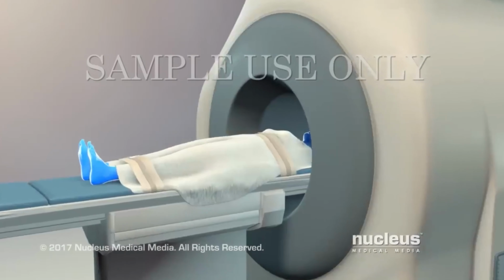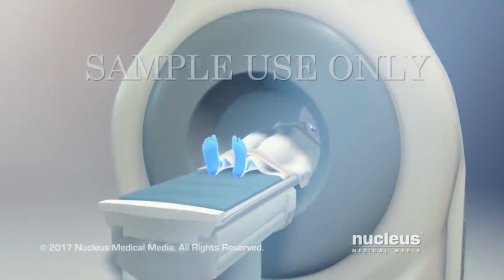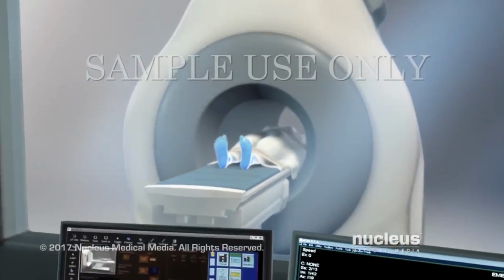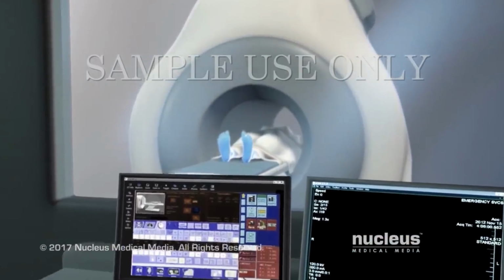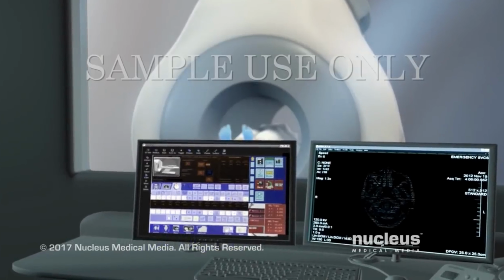To obtain an MRI image, a patient is placed inside a large magnet and must remain still during the imaging process in order not to blur the image. Contrast agents may be given to a patient intravenously before or during the MRI to increase the speed at which protons realign with the magnetic field. The faster the protons realign, the brighter the image.